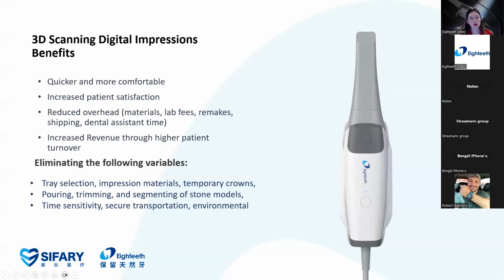So basically, what could give you an idea of the digital impression benefits? It's quicker, more comfortable for patients and doctors, and definitely increases patient satisfaction, and reduces materials, laboratory fees, remakes, shipping costs, and dental assistant time. And definitely increases the revenue through higher patient turnover, because all the patients are going to make a reference for their friends or to the doctor.